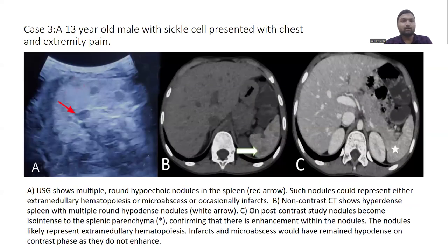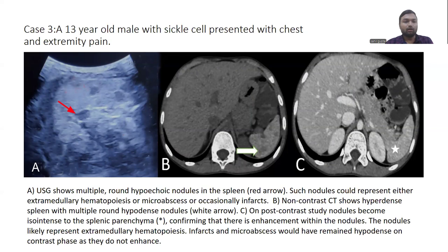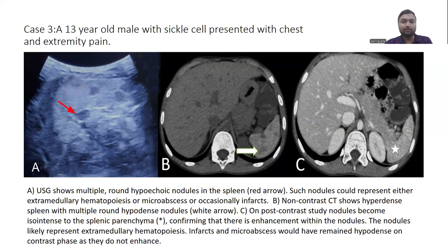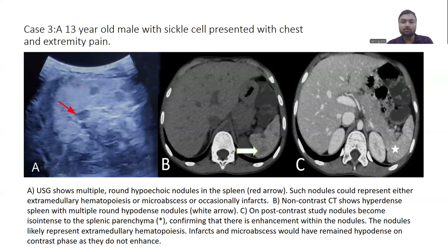Case 3: a 13-year-old male with sickle cell anemia presented with chest and extremity pain. Ultrasound showed multiple round hypoechoic nodules in the spleen, which could represent extramedullary hematopoiesis, micro abscesses, or infarcts. Non-contrast CT showed a hyperdense spleen with multiple round hypodense nodules. On post-contrast studies, the nodules became isodense to the splenic parenchyma, confirming enhancement — these nodules likely represent extramedullary hematopoiesis. In contrast, micro abscesses would have remained hypodense in the contrast phase, as they do not enhance.